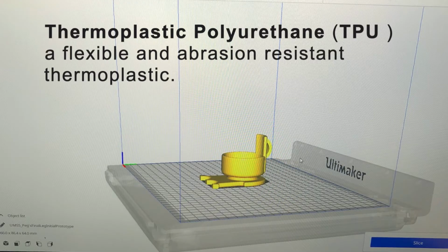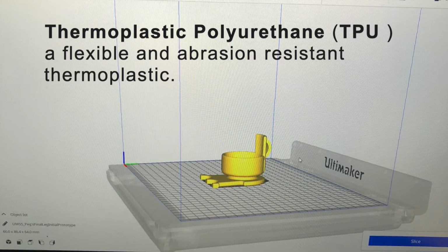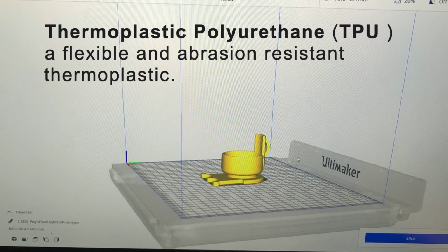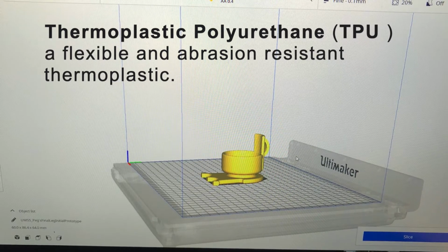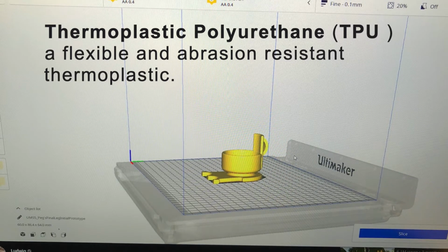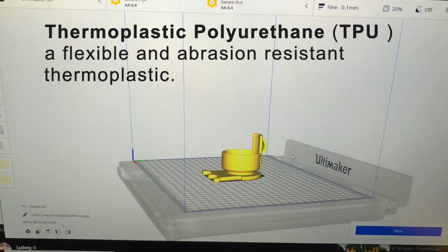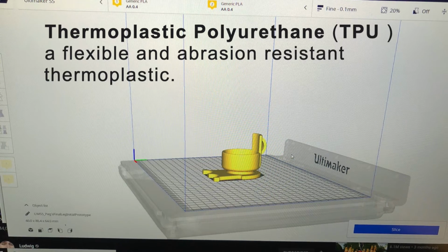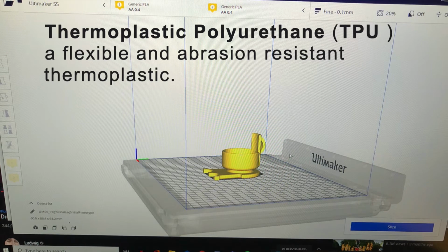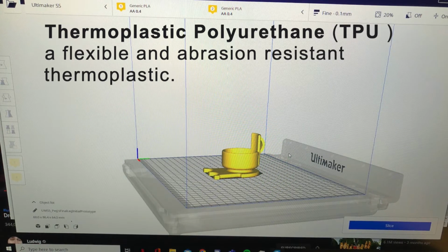After we determined what design we were going to use to print for our 3D prosthetic, we needed to determine our material. We decided on thermoplastic polyurethane, or TPU. We decided on this because of its flexible nature and abrasion-resistant capabilities. We liked that it had this abrasion-resistant capability because it meant to us that we would be able to give a product to Peg that would last long and not break down due to abrasion from different surfaces such as concrete, rocks, wood, or grass, or whatever Peg is walking on day to day.